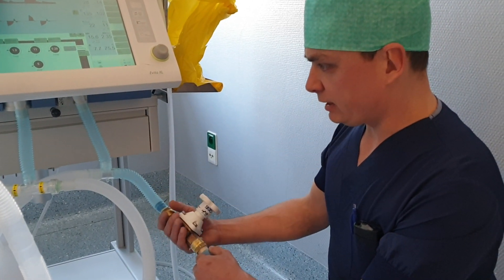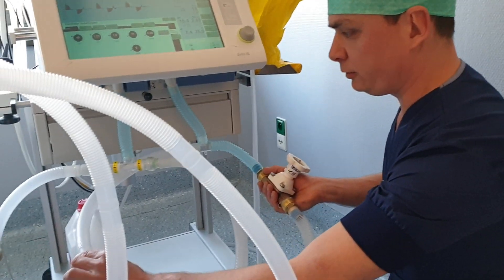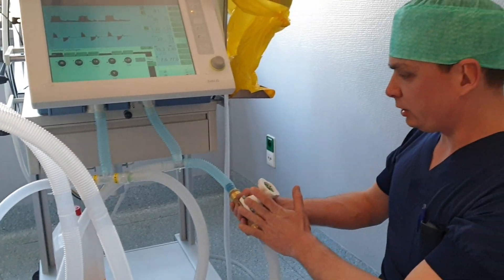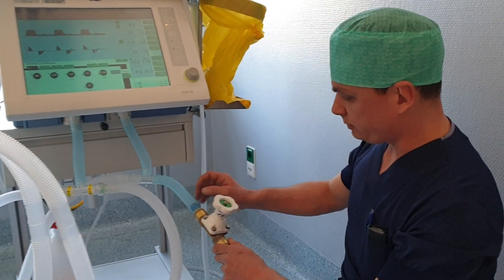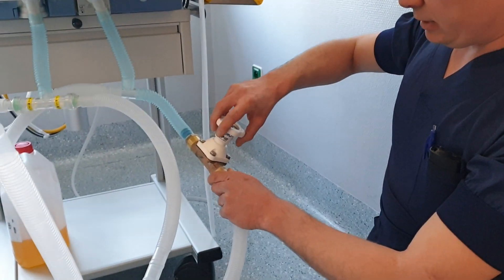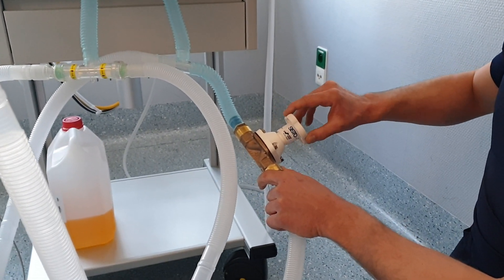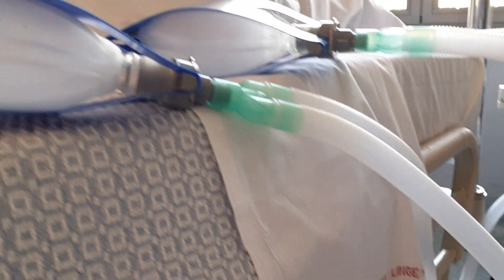On the inspiratory valve of each patient, ideally you would put a valve on each inspiratory limb. You can do it also with one limb, but ideally you would place a valve on the two. This is a valve on the inspiratory limb where you can adjust the pressure and thus also the volume to the patient.